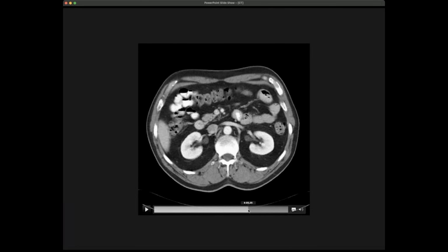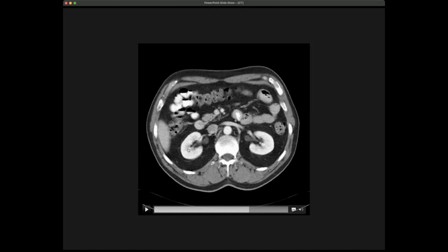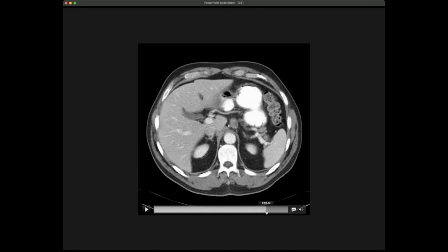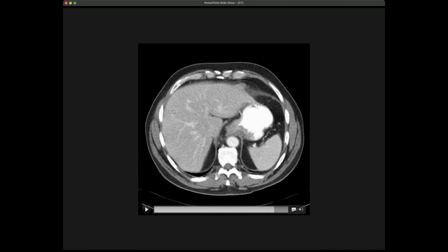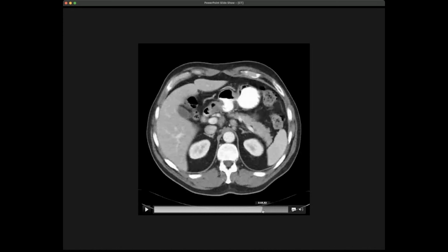And here you see something similar. So here you see two symmetrical structures appearing, which are clearly some organ structures. And so these are the kidneys. But again, the kidneys are bright, while they should be similar to muscle, soft tissue. So that means that some contrast agent has been used. And then you can go up. You see here the large liver, which is a big organ. And then you come here to the heart.